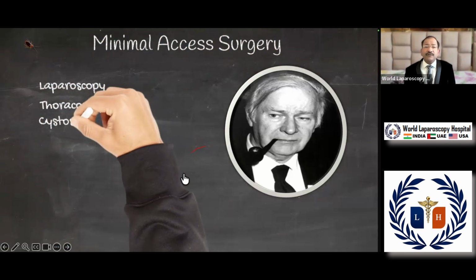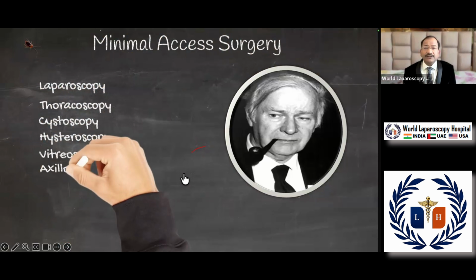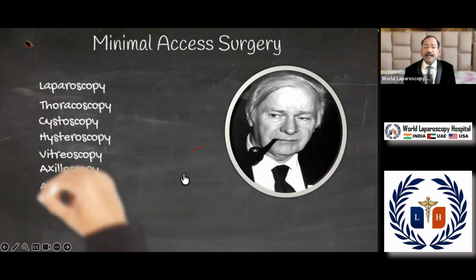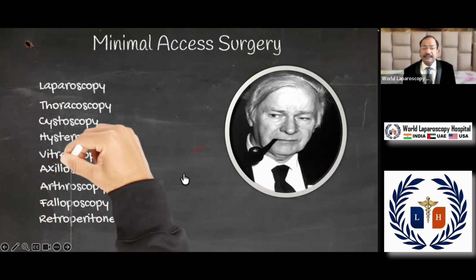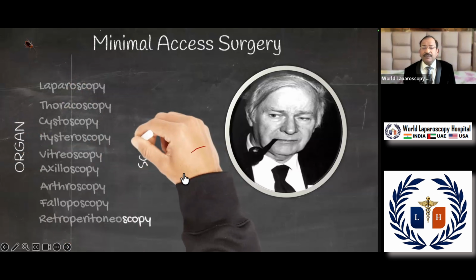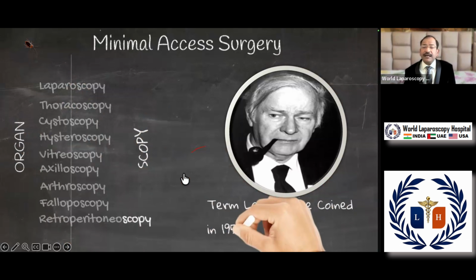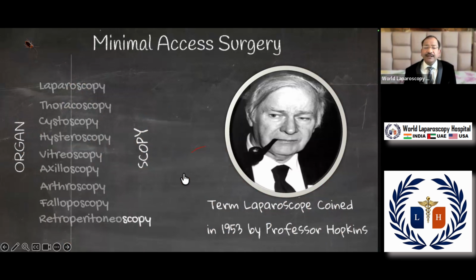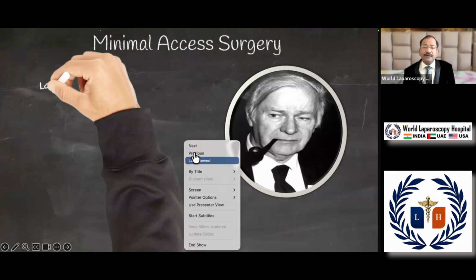The credit for revolutionizing minimal access surgery goes to this physicist, who invented the first rod lens system, and he coined the term scopy. Professor Hopkins is considered the pioneer who first, in 1953, invented the rod lens system, and today this rod lens system is used everywhere.